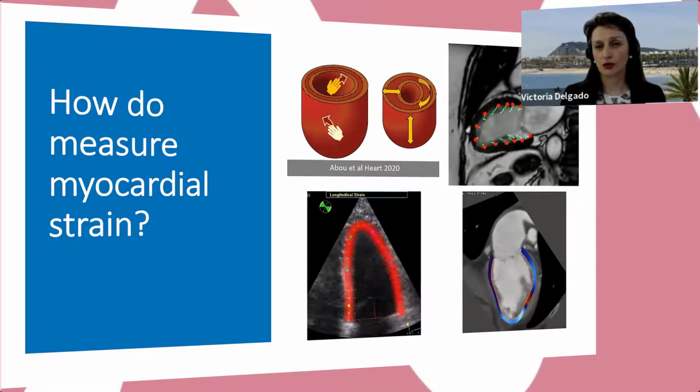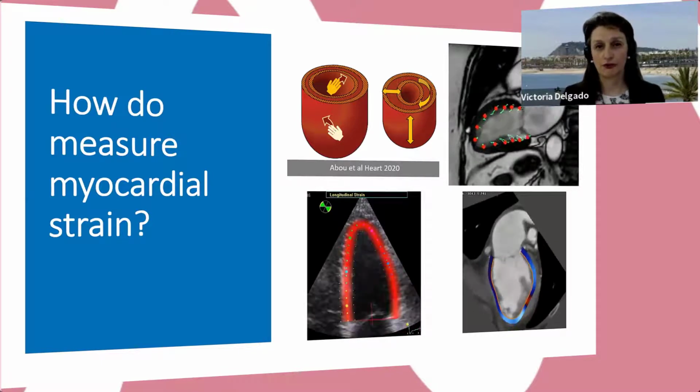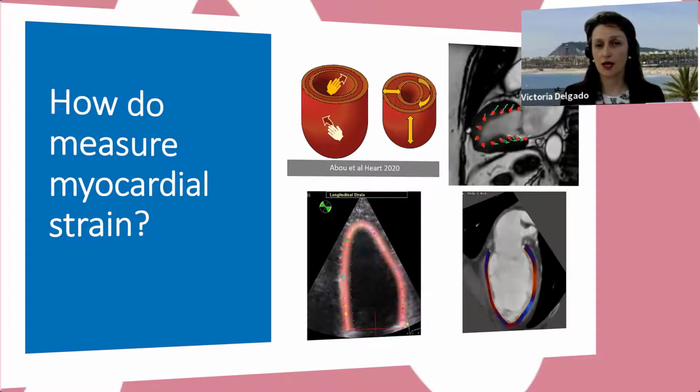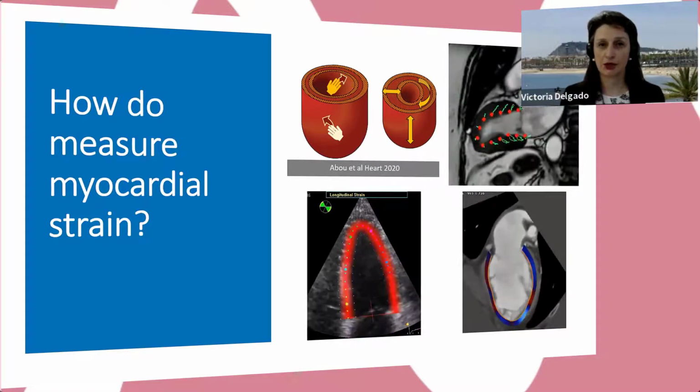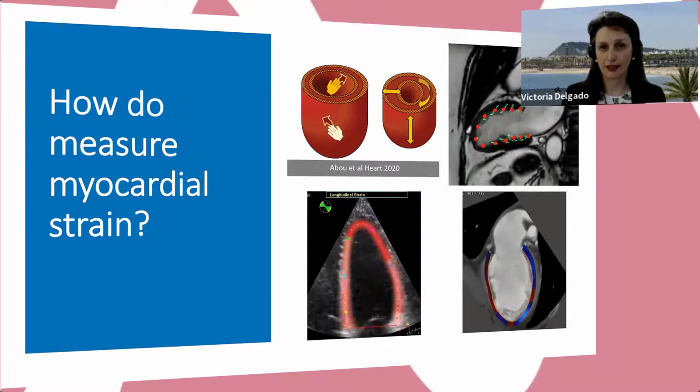We can measure all these deformations with echocardiography. We can also measure with feature tracking magnetic resonance, and most recently, there have been developments that can measure the myocardial deformation on computed tomography data.